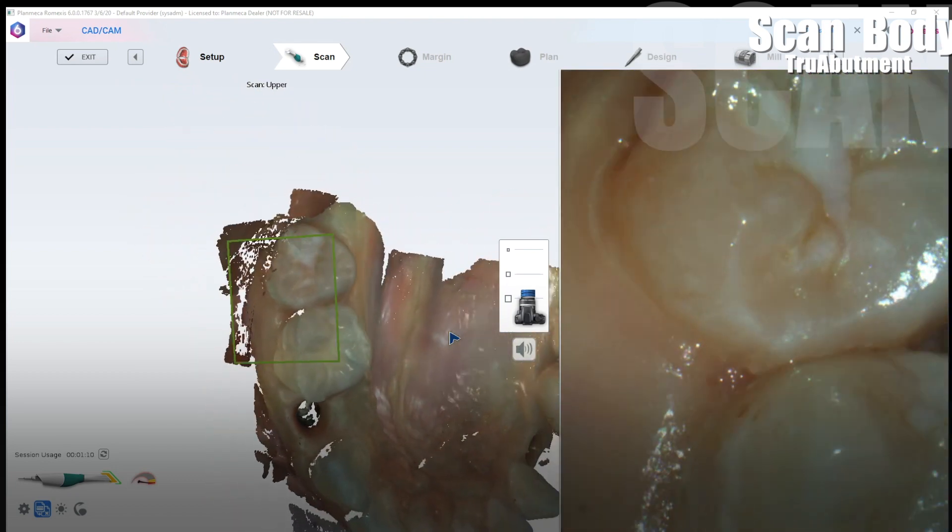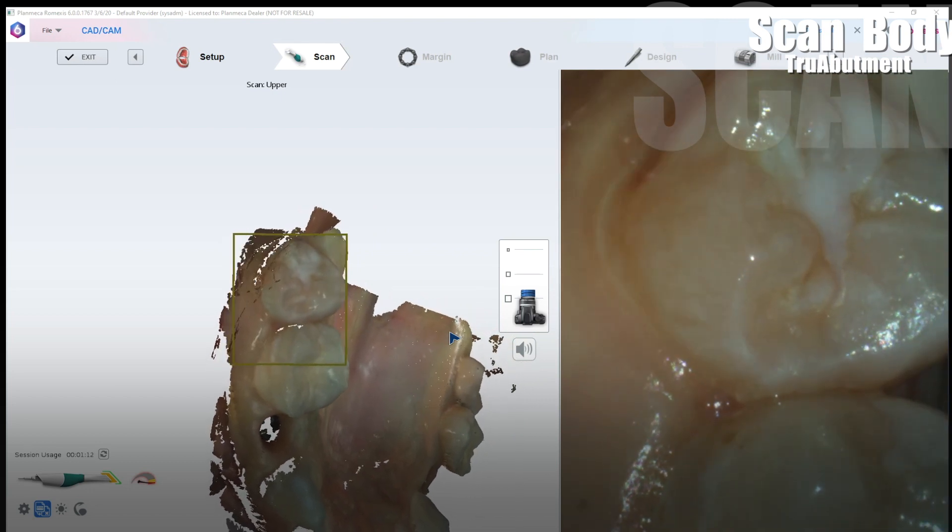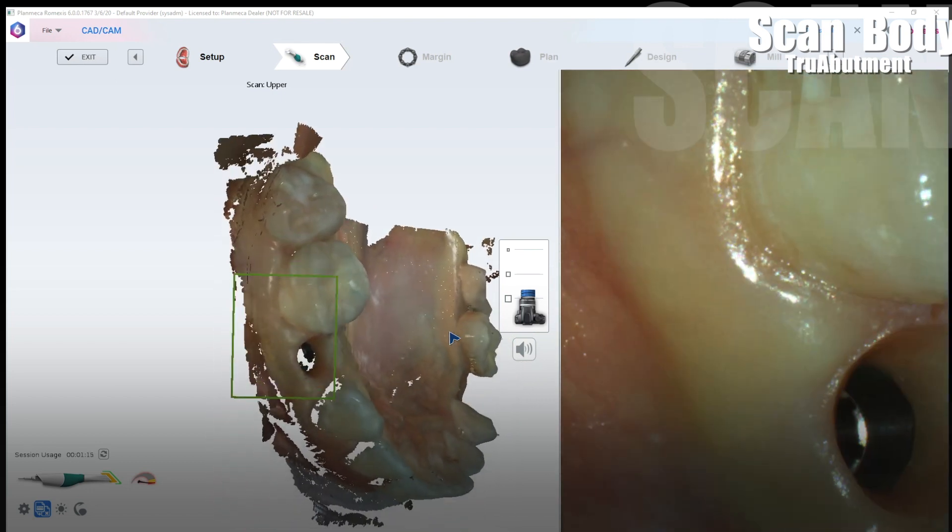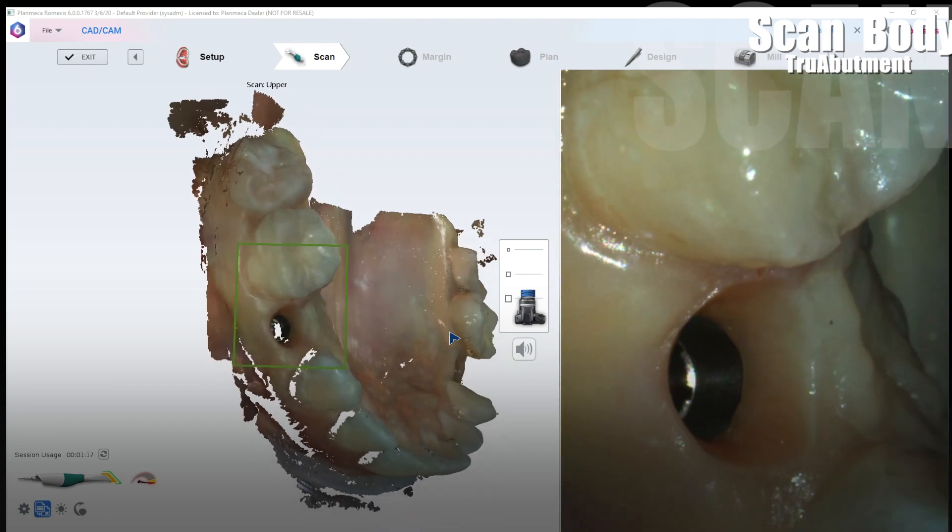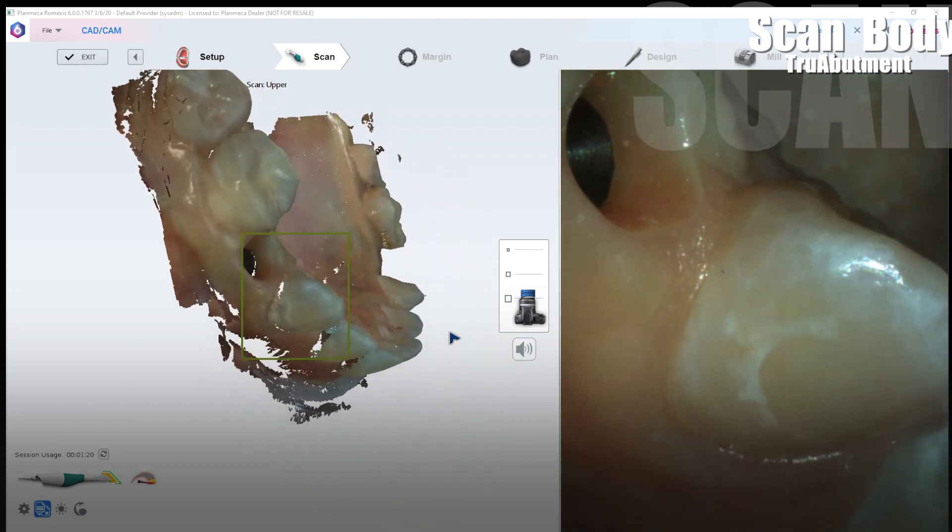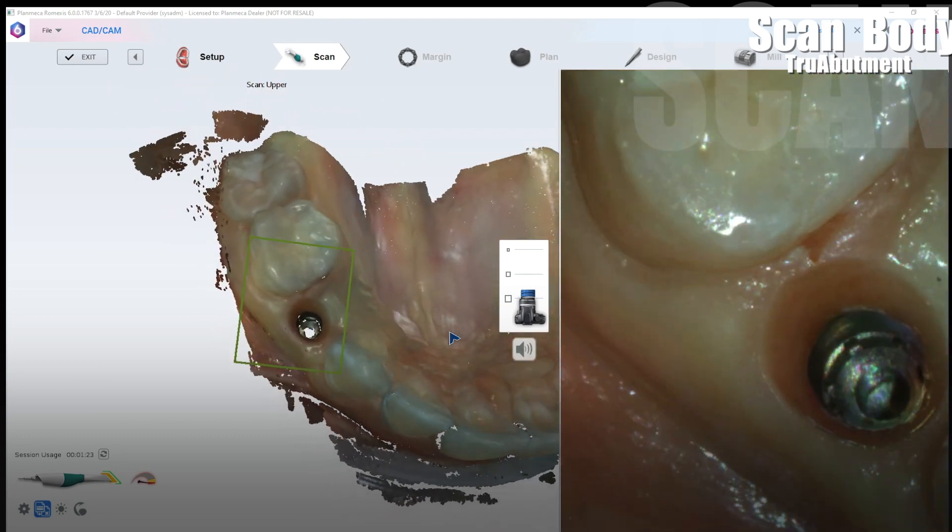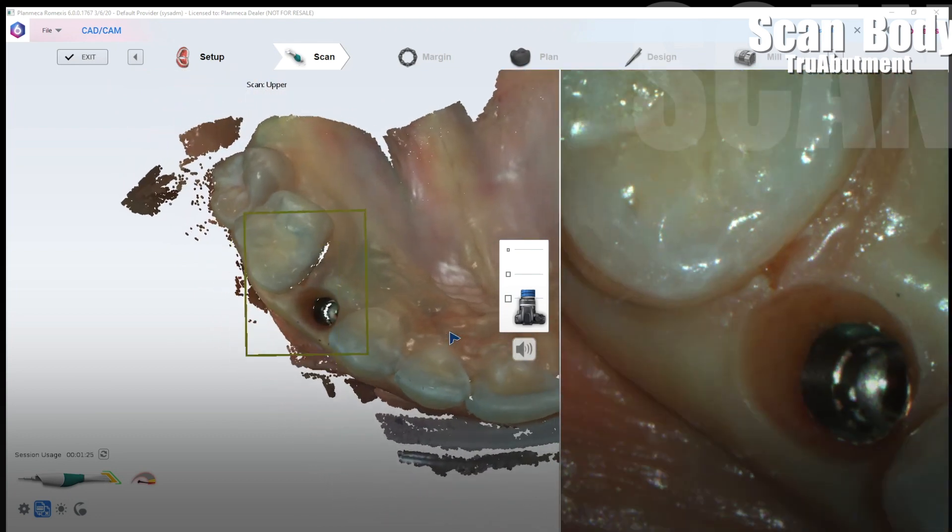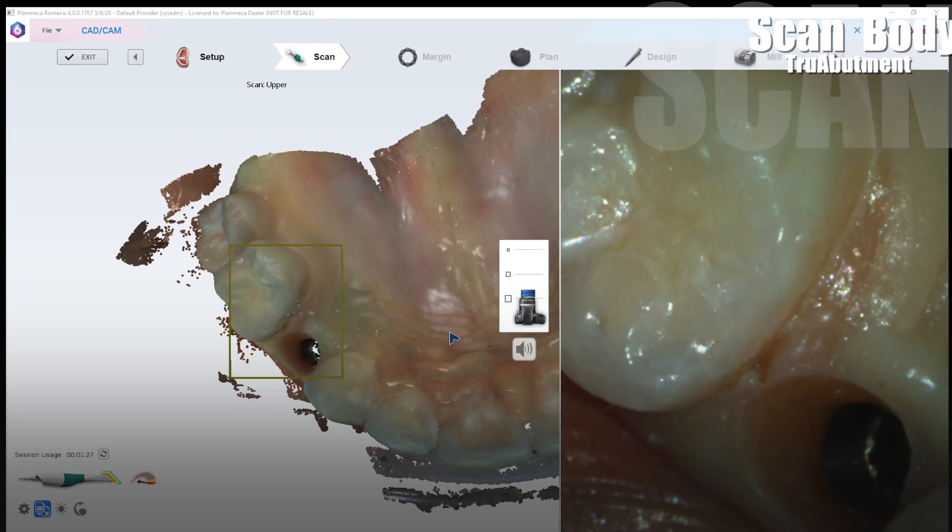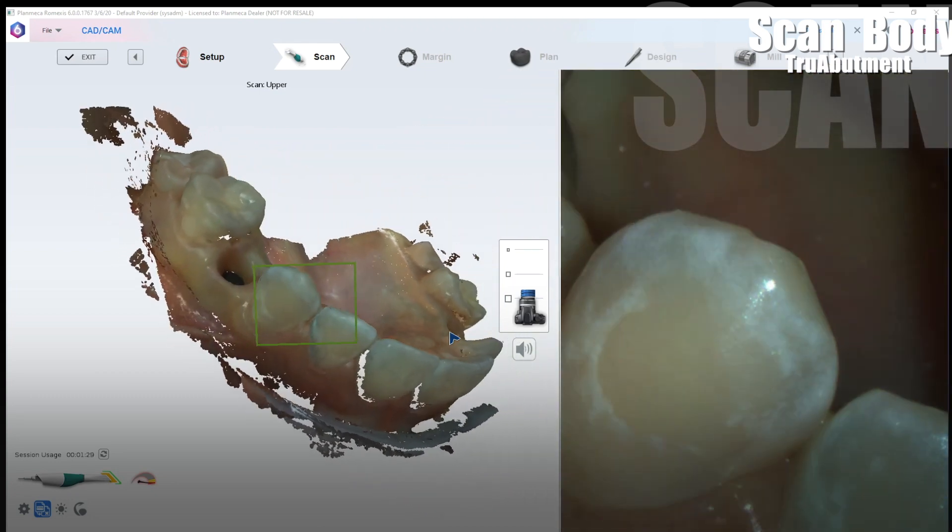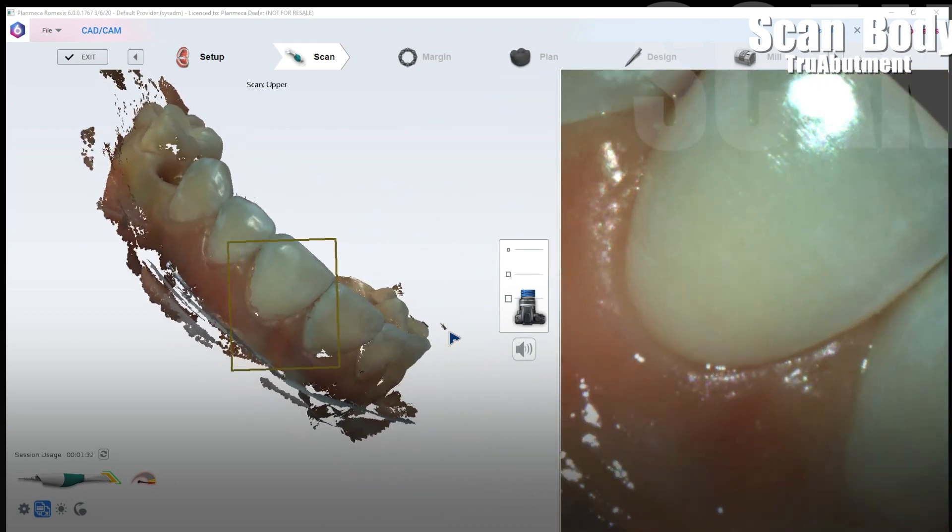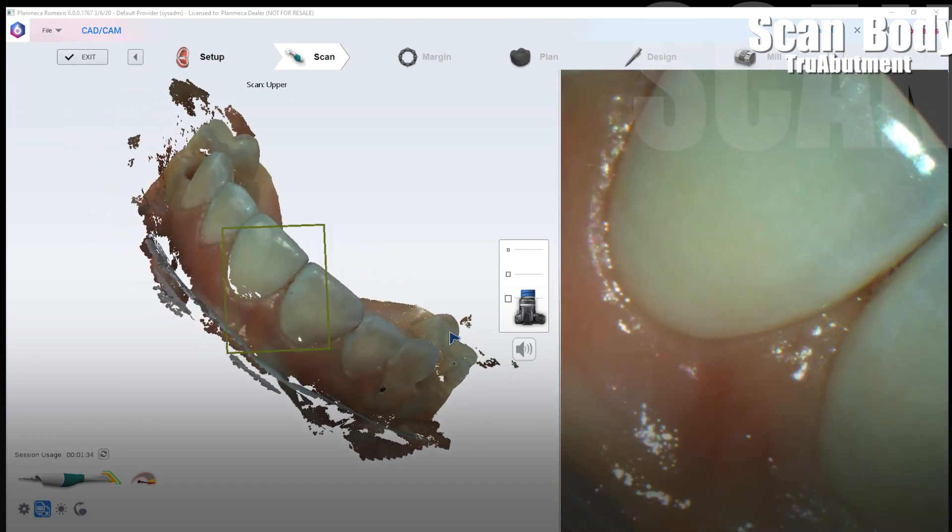The last thing that I'm going to do is capture the straight facial. I'm going to roll really heavy here. Making sure I focus on those proximal contacts so that the lab has good surfaces to which to build the proposals. Whether you're milling them yourselves or having them mill it doesn't matter. You still need really good scans. Filling in all this data here.